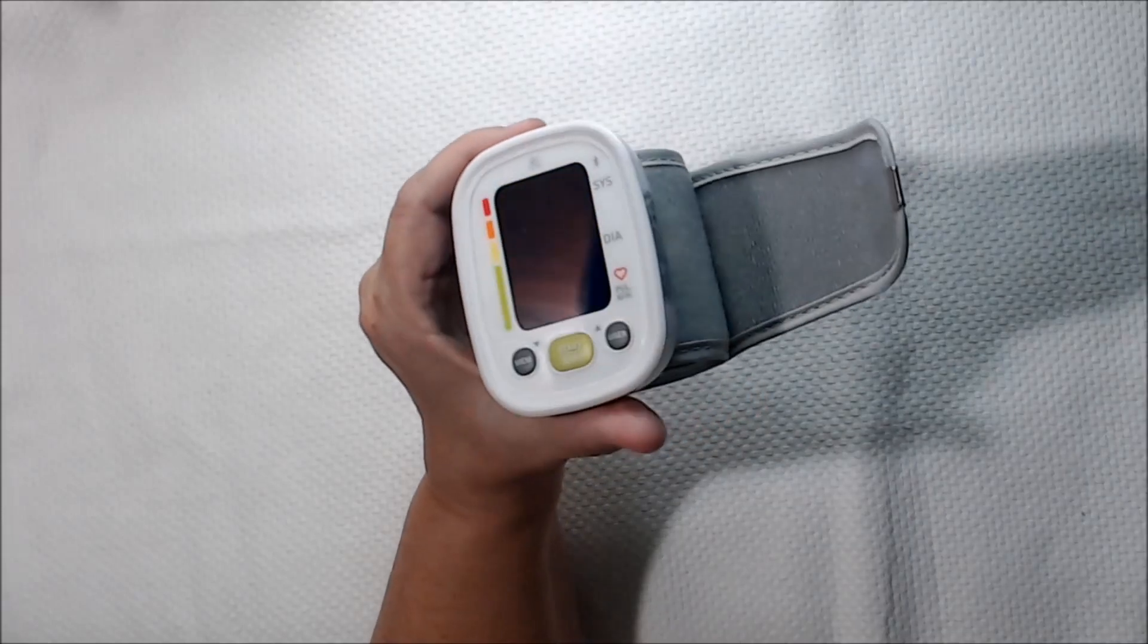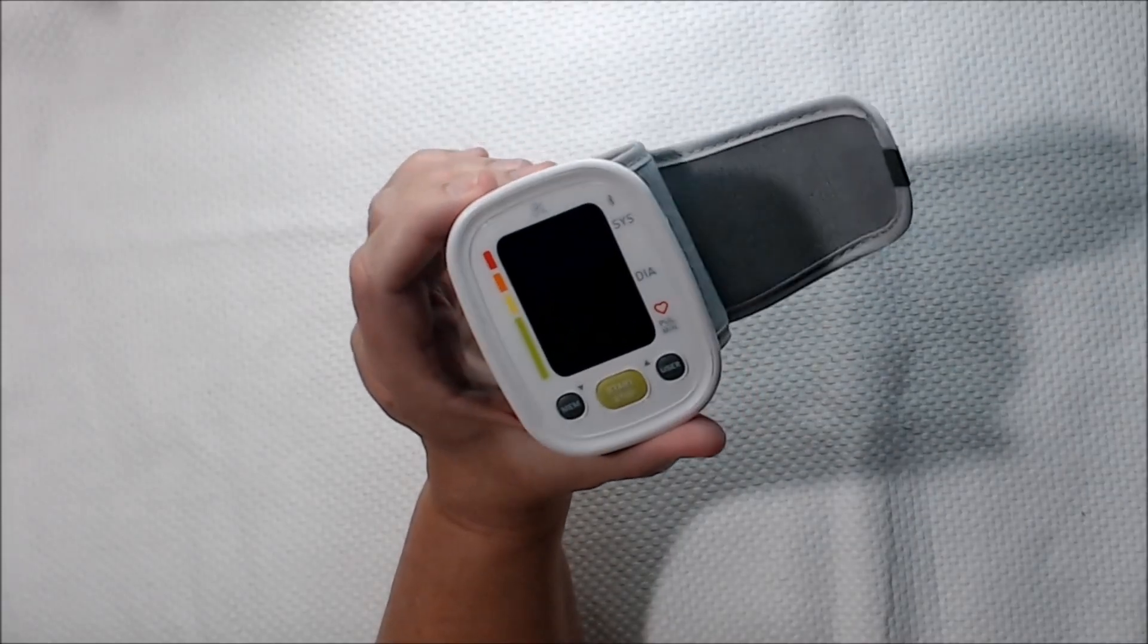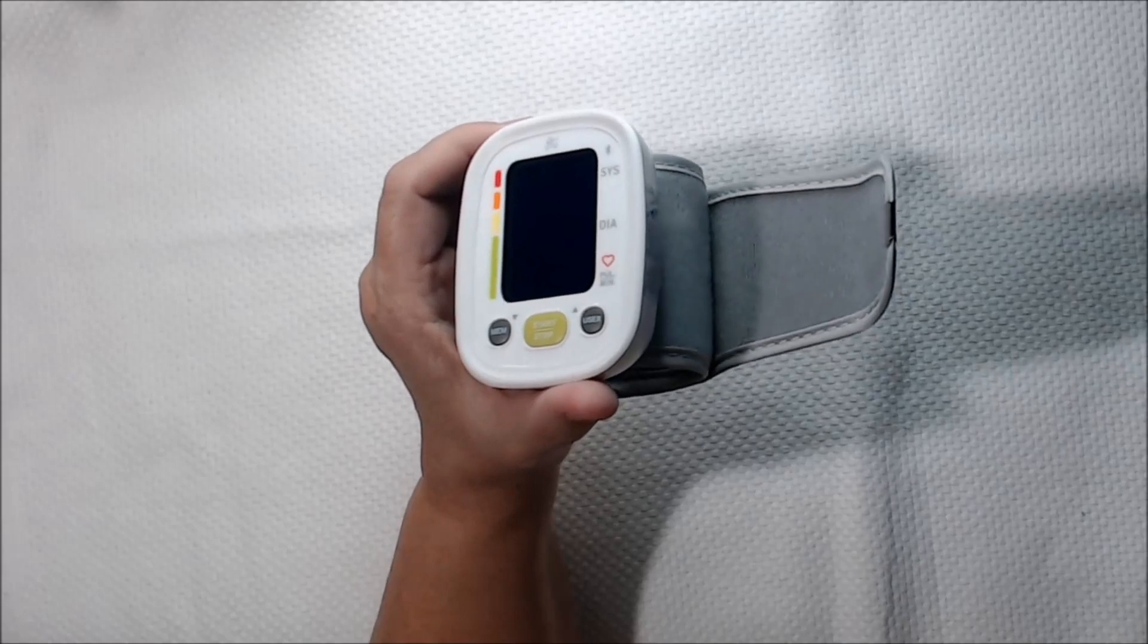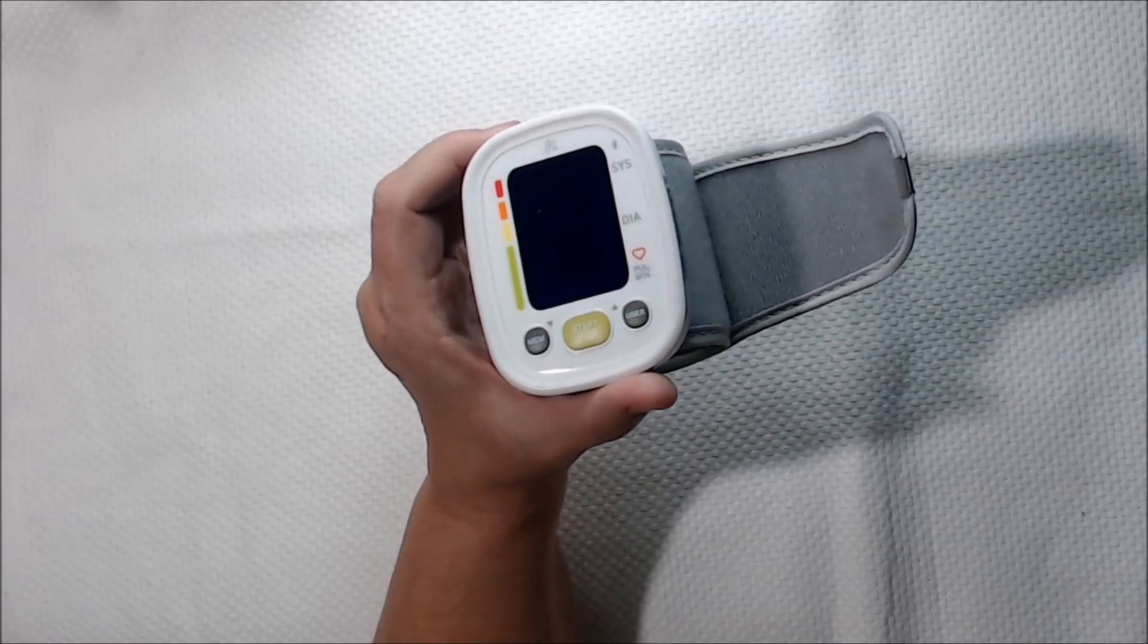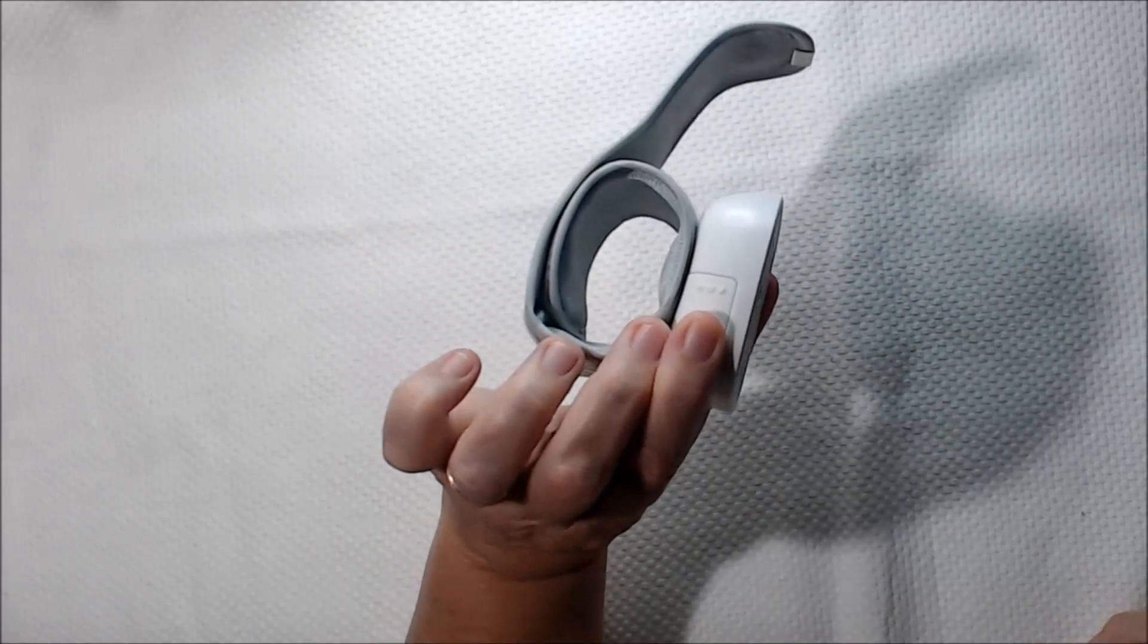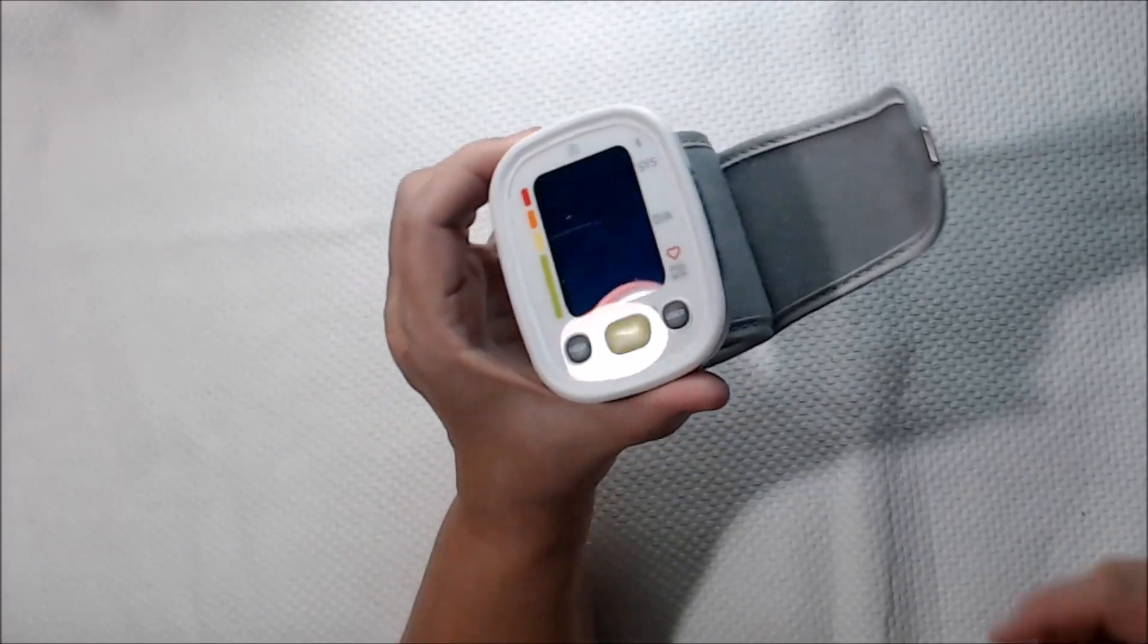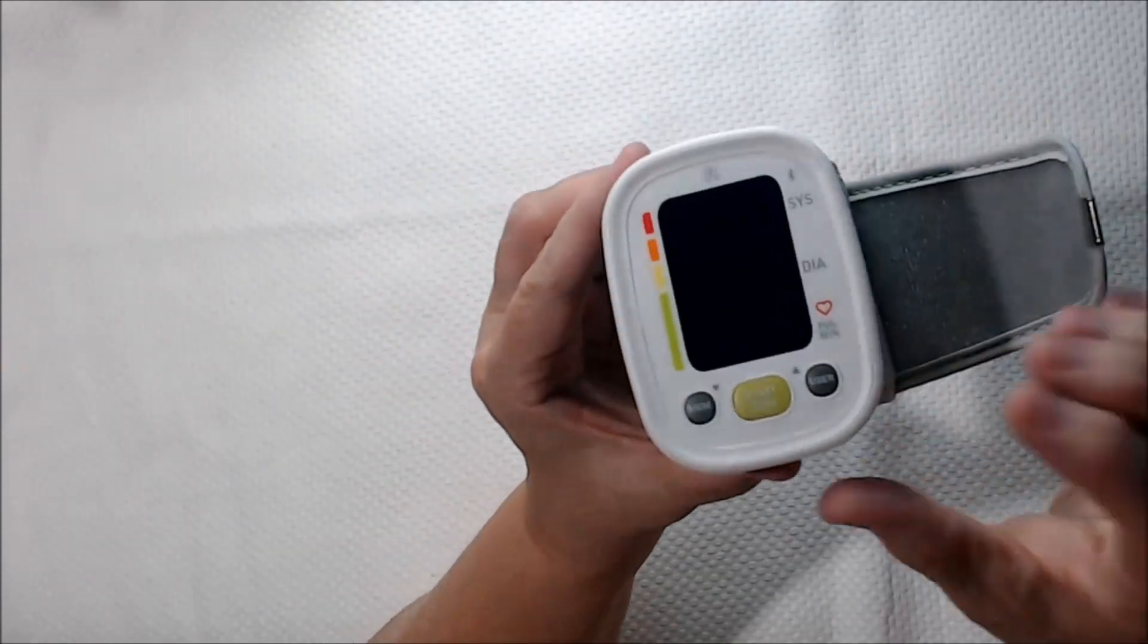What we're looking at today is a Bluetooth blood pressure monitor that you can put on your wrist and track your blood pressure. It has some great features.